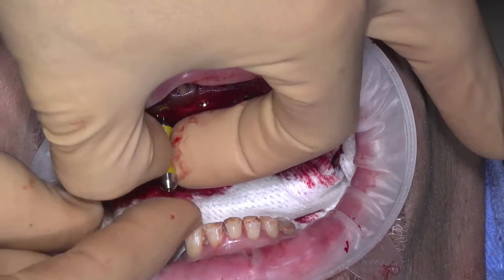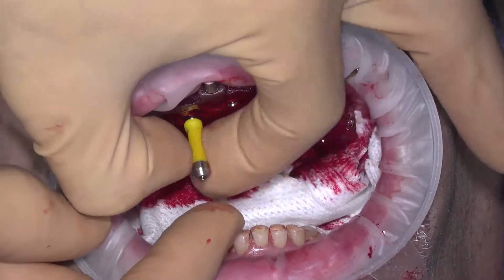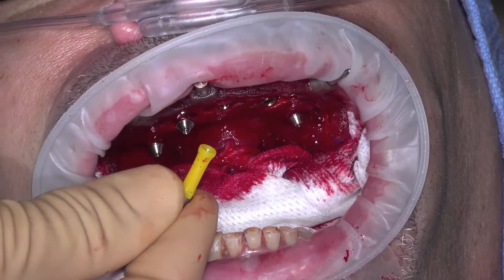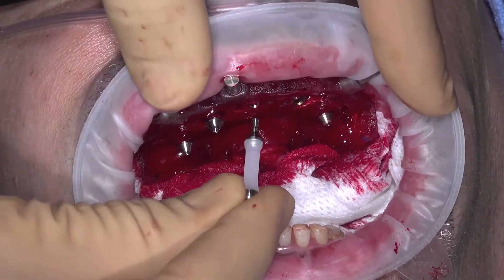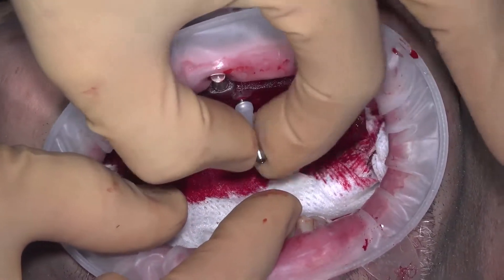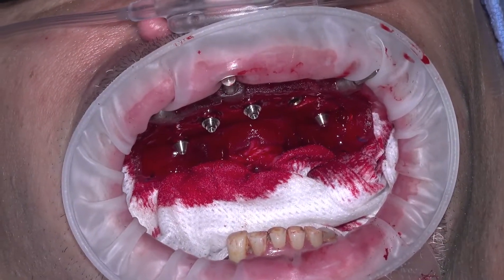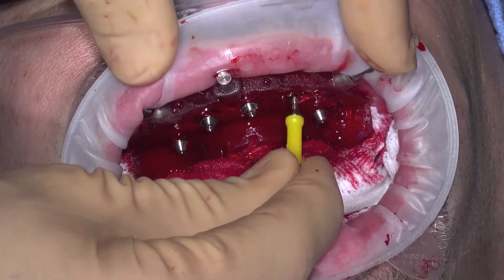Additionally, many implant manufacturers will have the multi-unit abutment healing cap attached to one end of the carrier, as shown here. The final tightening is done with a multi-unit driver. Please note, often these straight multi-unit drivers are not included in the implant manufacturer's surgical and/or prosthetic kits. Final torque of all multi-unit abutments will vary based upon the placement insertion torque of the implant and the implant manufacturer's recommendations.